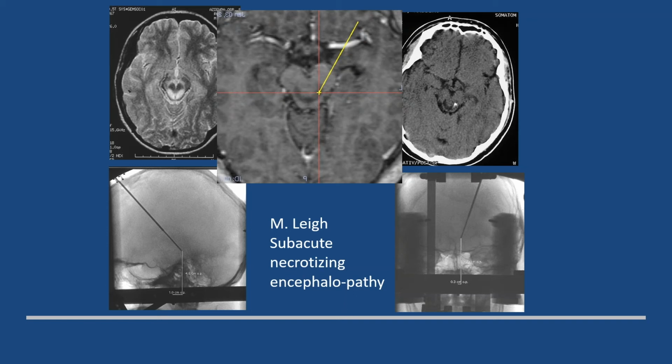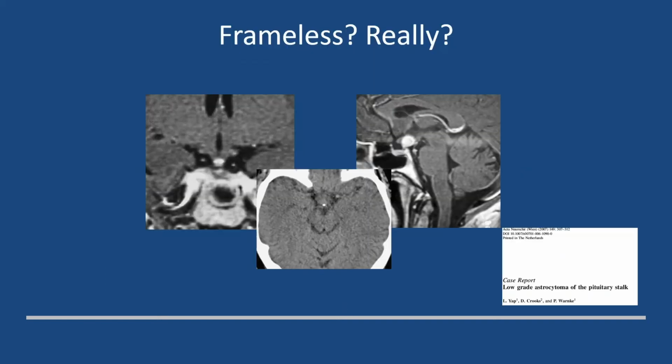And that actually leads to a significant increase in diagnostic yield, which in our series, which is more than 5,000 now, is about 97% from frame-based stereotactic biopsies. And it's particularly good if you have very delicate, very small lesions. This turned out to be a lesion, actually a tumor of the infundibulum, which actually was a pilocytic astrocytoma. And again, on the CT scan, you see our marker is placed in the lesion.